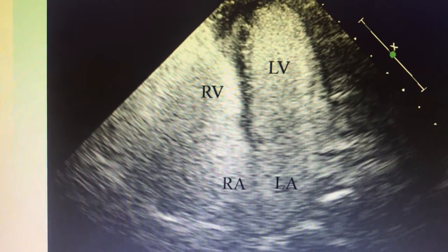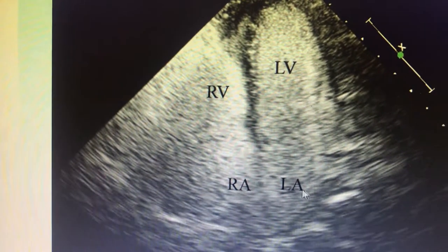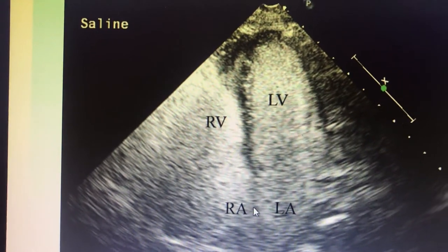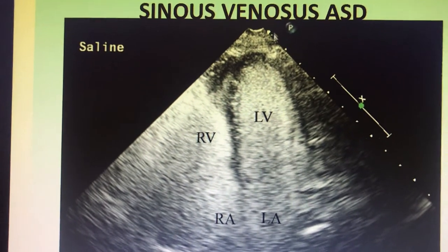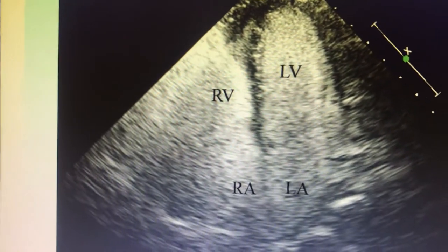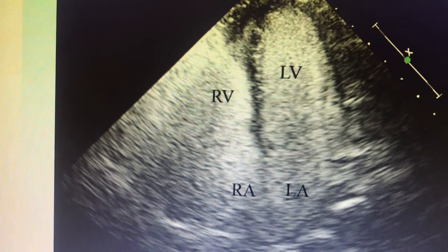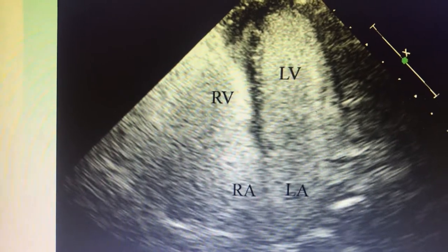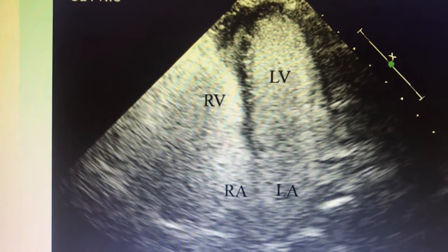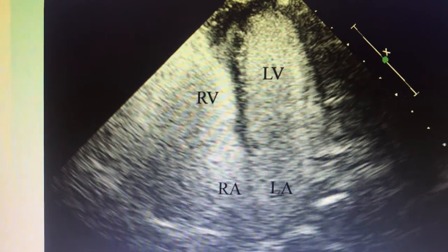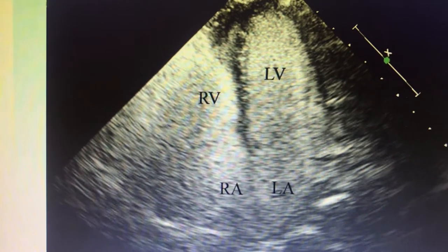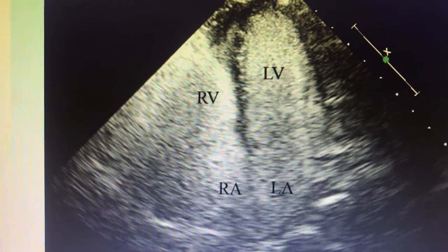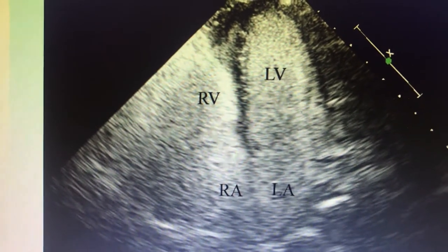Similarly, this kind of patient who didn't appear to have any interatrial septal defect is actually getting complete filling of the LA and LV within one or two cycles. This is an example of sinus venosus ASD, where we have great difficulty in detecting the ASD defect directly, but you can be sure that there is a defect because the right atrium is usually dilated and there is some pulmonary hypertension. You will then search for the sinus venosus ASD through TEE, or simply use contrast echo first to justify that further workup is needed.